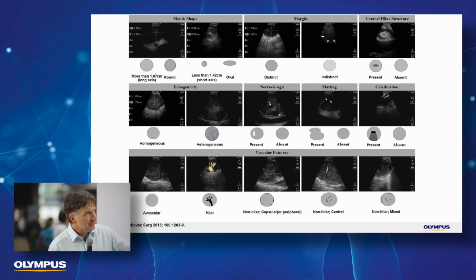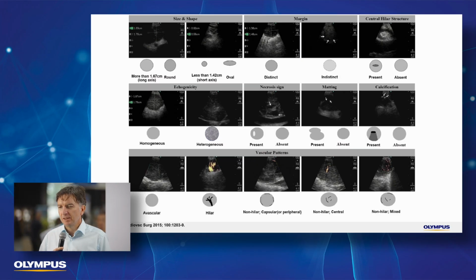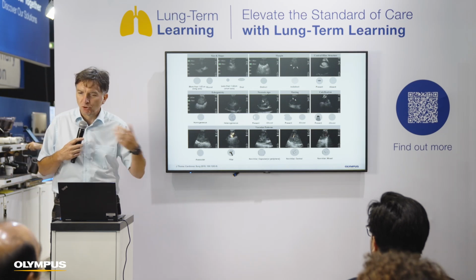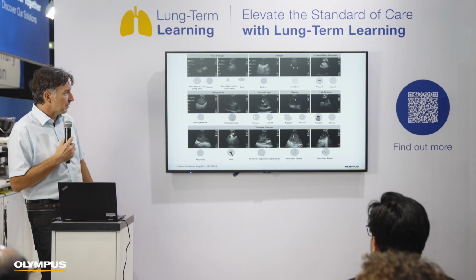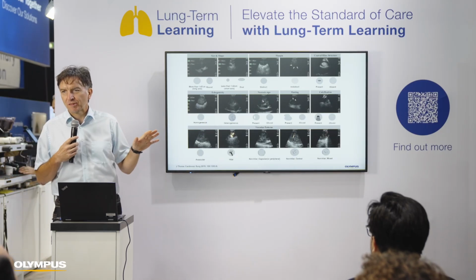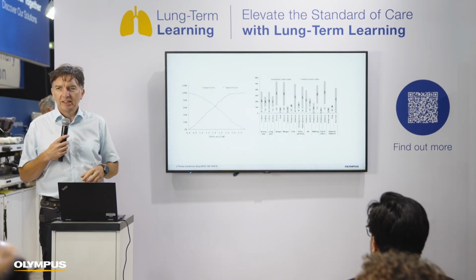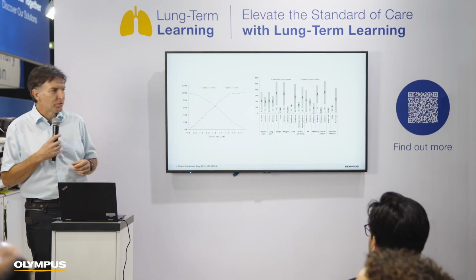So you see many different features and you get an impression. If you are quite confident that the lymph node has benign features and your puncture at the end is also benign, you can be quite confident that your result is okay, and the patient maybe does not need to be pushed to another invasive procedure like mediastinoscopy, if you're talking about lung cancer. But if you find it suspicious and your result is cytologically negative, then keep this suspicion and maybe plan the next procedure. That's basically the whole story about that.